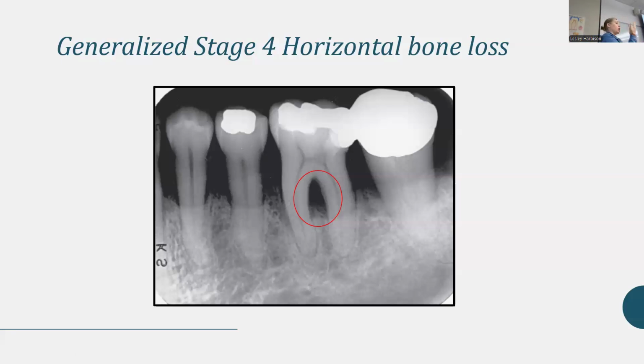It's the same thing when I talk to you about a horizontal overlap. Is it more or less than a third? You've gotten really good at it, but you still don't always get it perfectly. Sometimes you ignore it when it's too much or you count it when it's too little. So you have to get that designation in your mind: is it more or less than a third? It's really the same thing with root length.